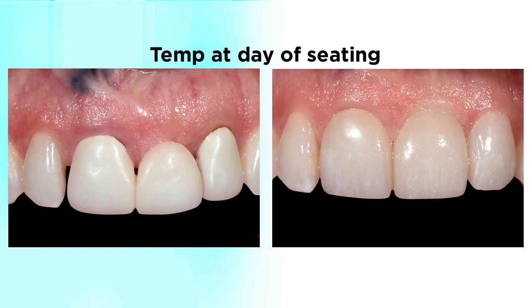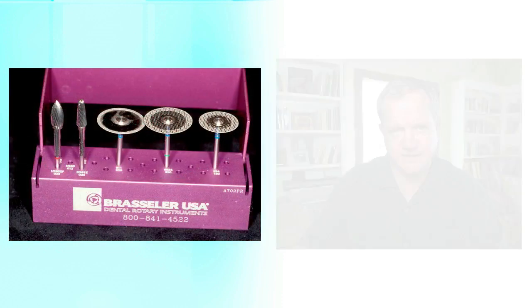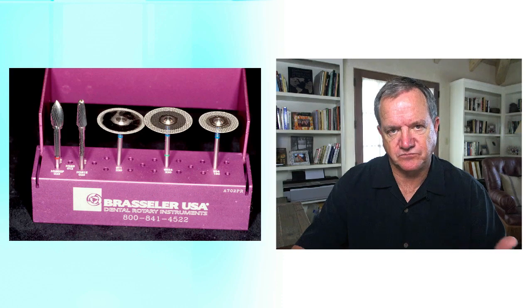And the 2 centrals should have the mesial straight, the distals convex, the facial surfaces having the emergence plane, the facial plane, and then tipping back. And then here's the final restoration in this patient. So let me show you how that actually occurs in terms of the laboratory.